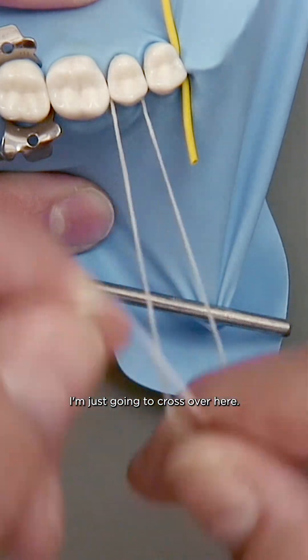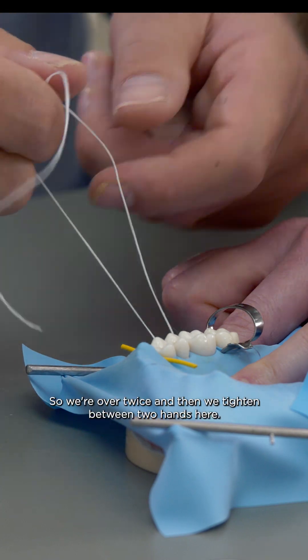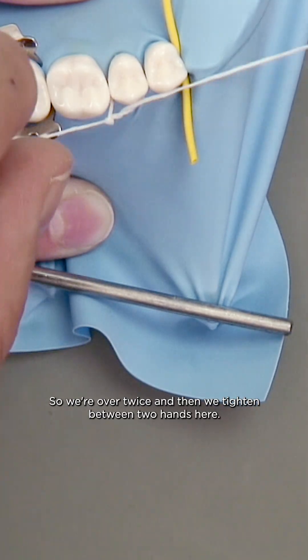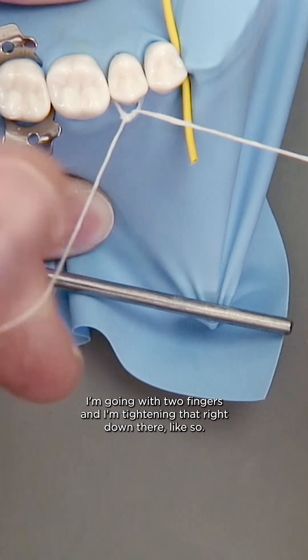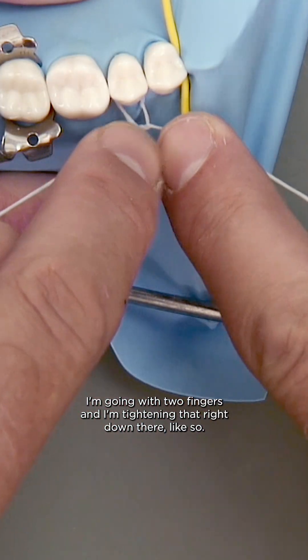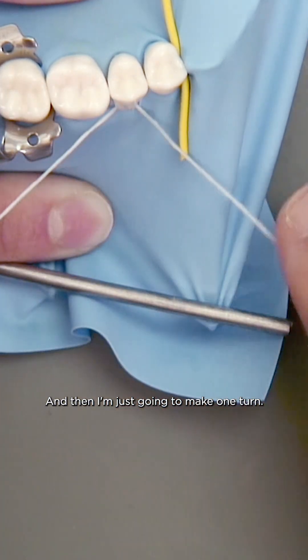I'm just going to cross over here — one, two — so we're over twice, and then we tighten between two hands here. I'm going with two fingers and I'm tightening that right down there like so, and then I'm just going to make one turn.